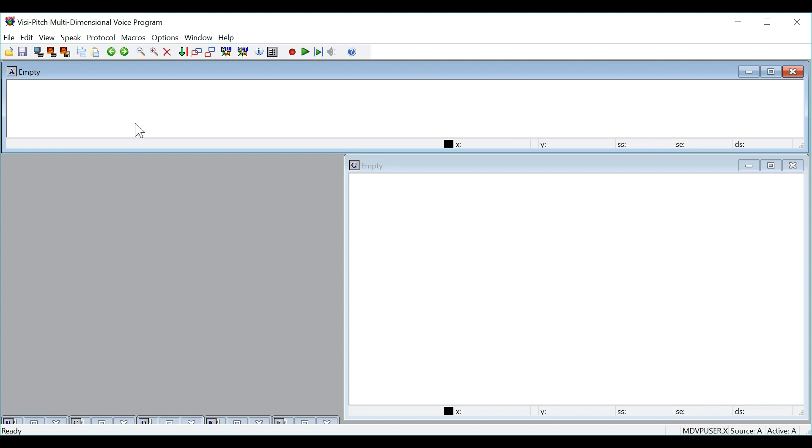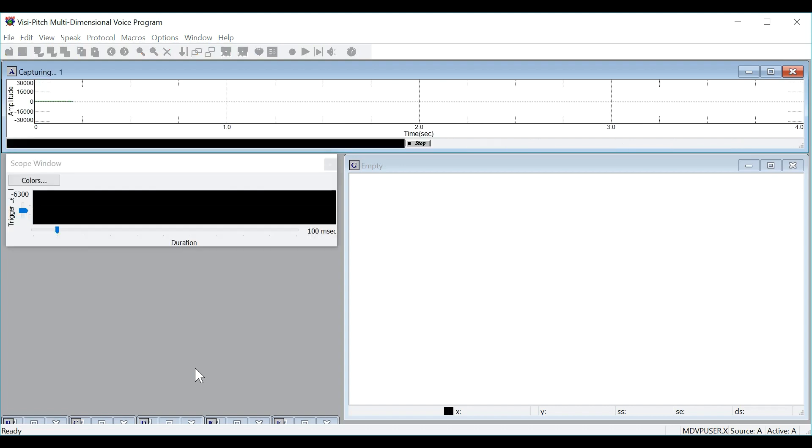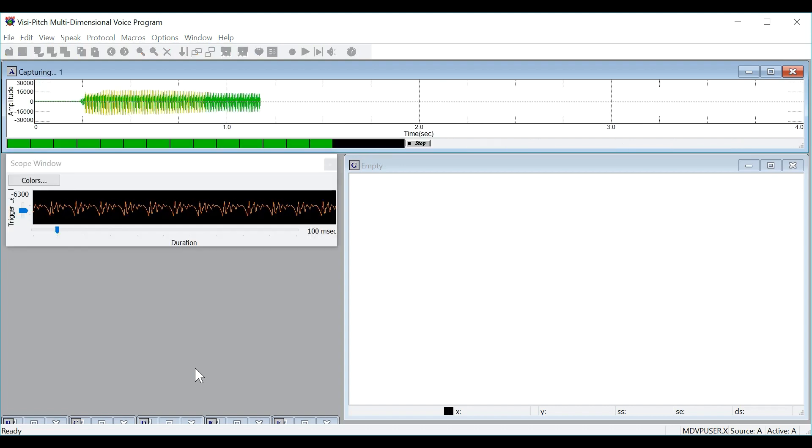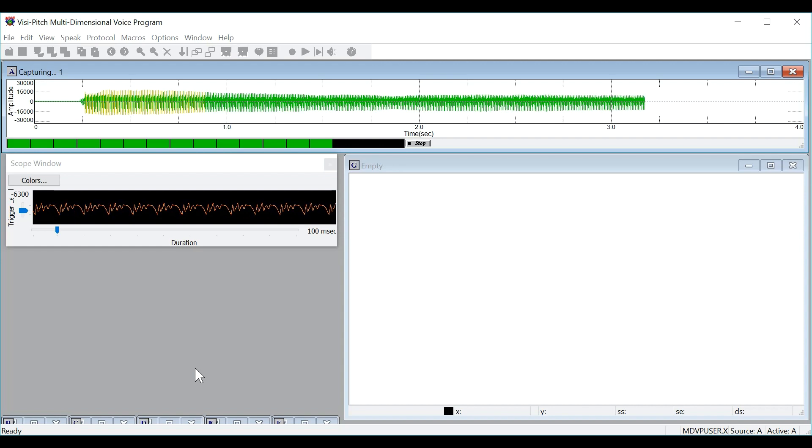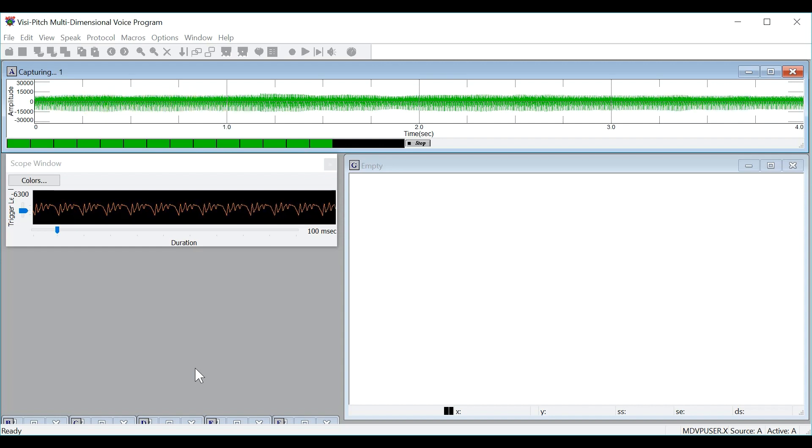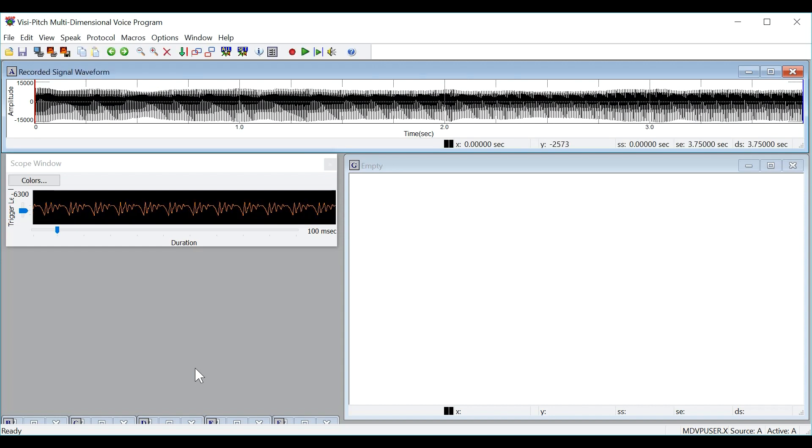We will begin by recording a sample of a sustained vowel A, and we will take note to ensure that the sample fills the entirety of window A. We will begin recording either by pressing the record button on the toolbar, or using the F12 key. Notice that I let the sustained phonation fill the entirety of window A.